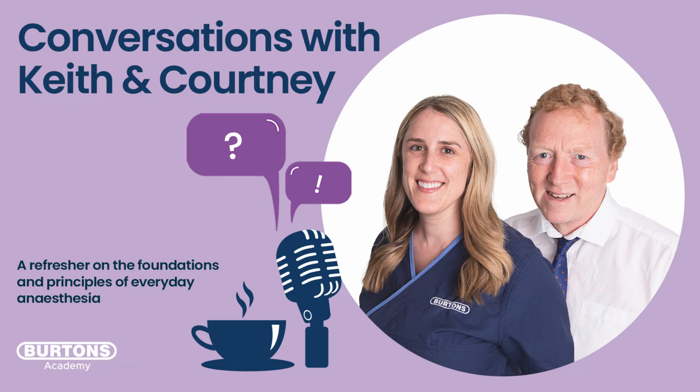I think thinking about minute volume really comes into its own when you're thinking about a ventilated patient, because then you have to think about those things independently, and you actually use real numbers. When the animal is spontaneously breathing, you don't have those numbers to hand because you don't know what the volume is. You know what the frequency is, but the concept is still there. If they're hypercapnic, they are hypoventilating. The minute volume is too low. So we think in terms of minute volume.